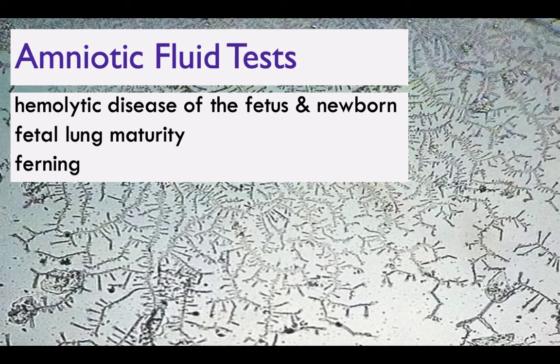The last thing I just wanted to talk about, it's kind of a test, but kind of not, is ferning. If you look at the background of this slide, we've talked about the fact that you have to decide, is something urine or is it something else? And when a pregnant woman's water breaks, they oftentimes will either think they peed their pants, or maybe they did pee their pants and it's actually amniotic fluid.